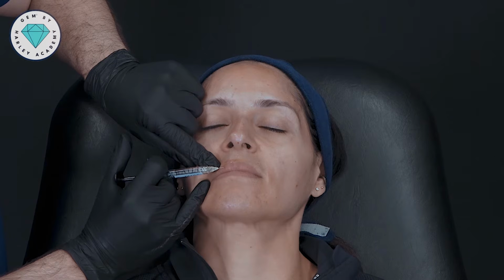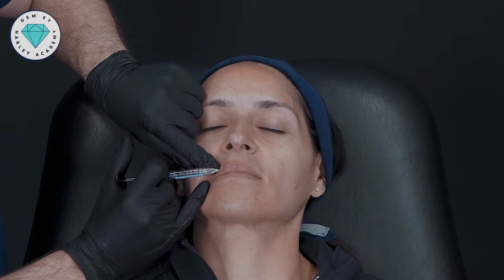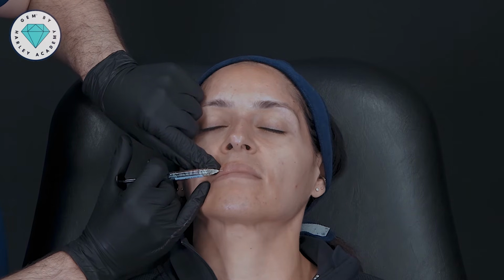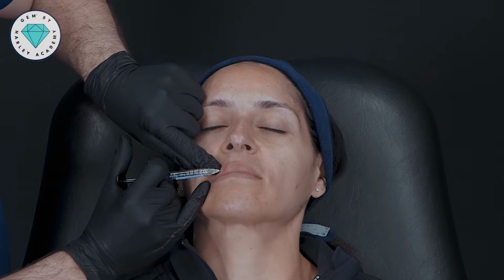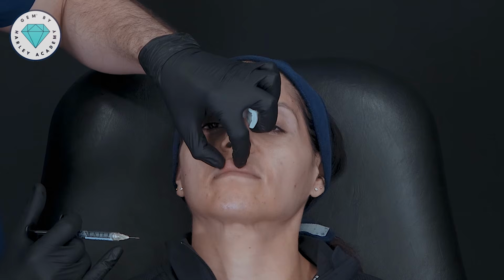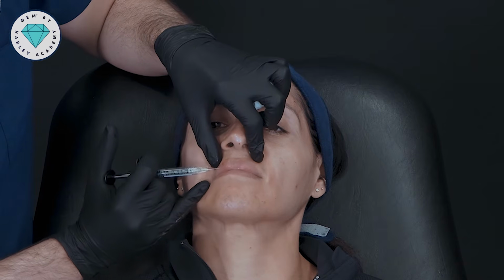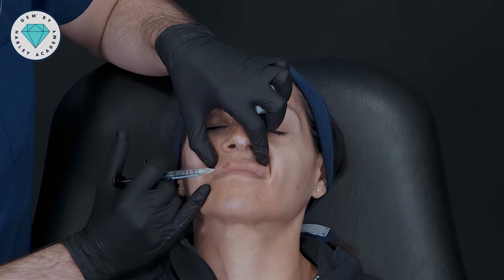And I'm just going to go for a 0.1 ml bolus, because we're injecting really nicely low viscosity products that will flow. They're also cohesive, so they stay together. And even just after injecting 0.1 here, I can feel the gel between my fingers. It's traveled all the way to the midline. So that's how I'm going to create this very natural projection to the upper lip. A little one here as well.